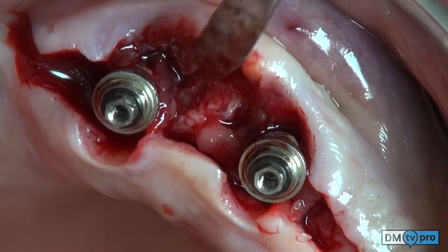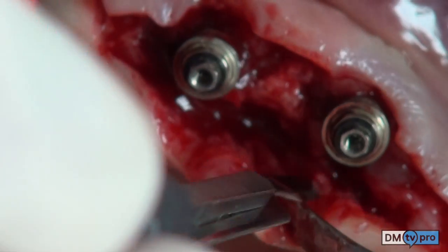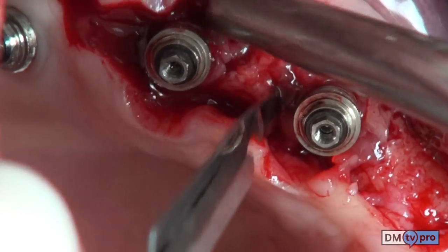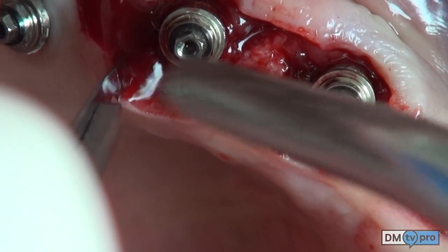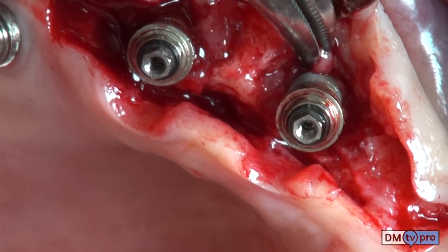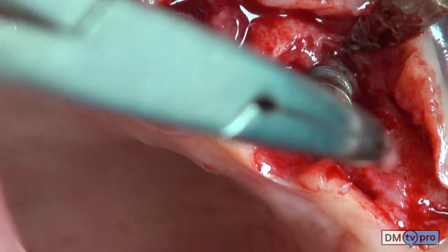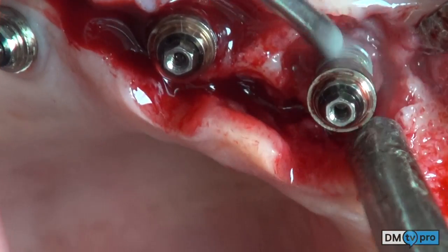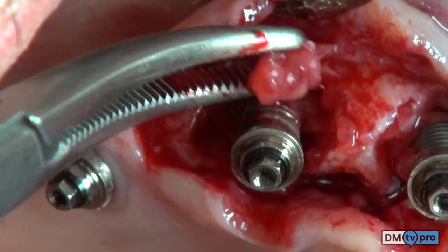With the blade, the granulation tissue inside the defect is easily removed. A clamp forceps is used to continue soft tissue removal inside the defect. With ultrasonic instrumentation, the defect is cleaned and the soft tissue further removed.